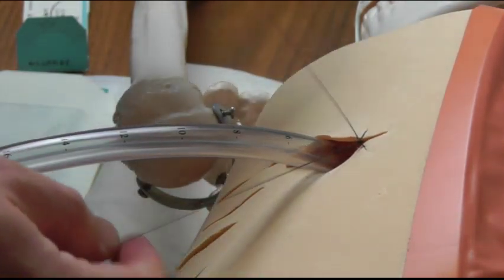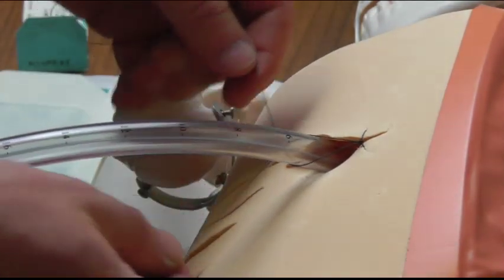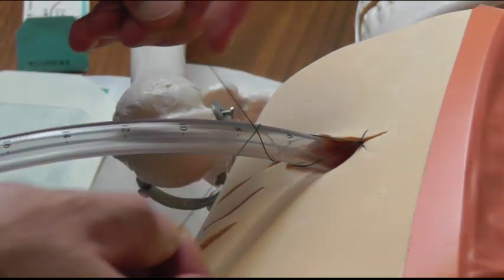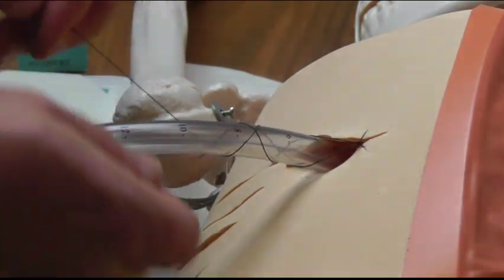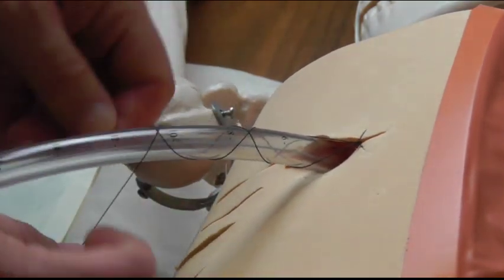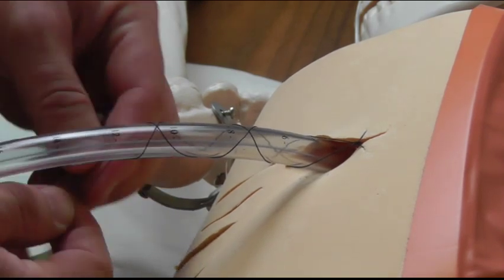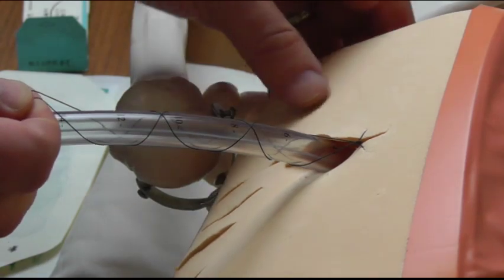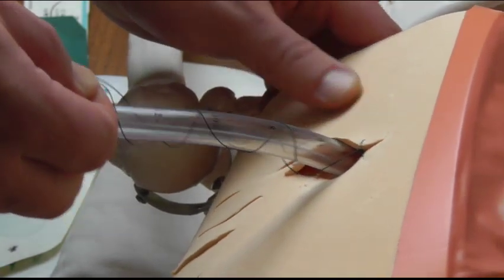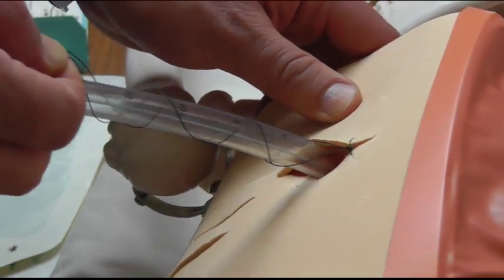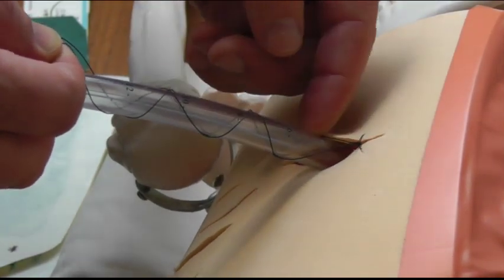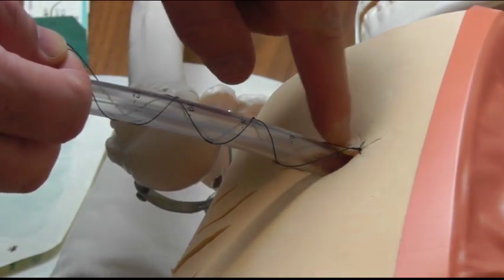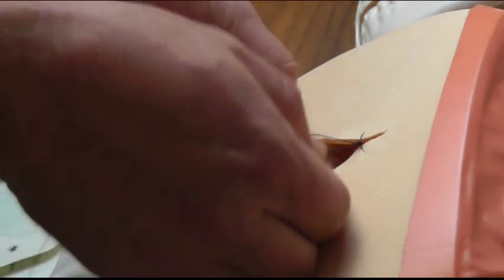Now what you want to do is bring that around the tube. In the old days we used to teach people this Roman sandal technique, where you'd come out along the tube like this, and you'd make these lovely patterned ties around. It looks great, doesn't it? Roman sandal. The problem with that is, it allows the tube to move too much. It can move in and out, and when it does, you're going to draw bacteria into the wound in the chest and increase your risk of an empyema.